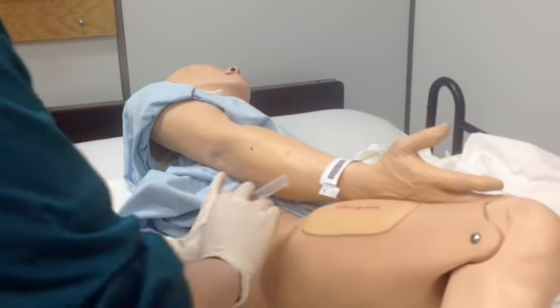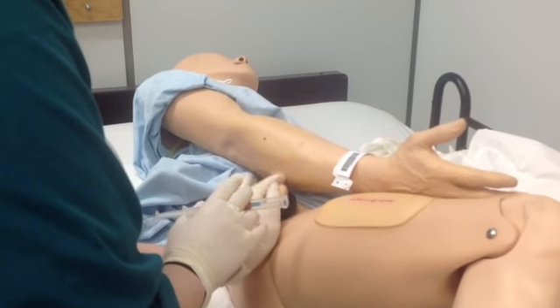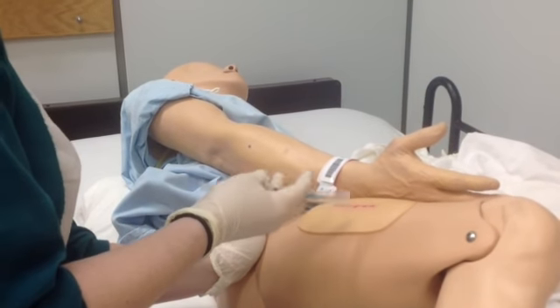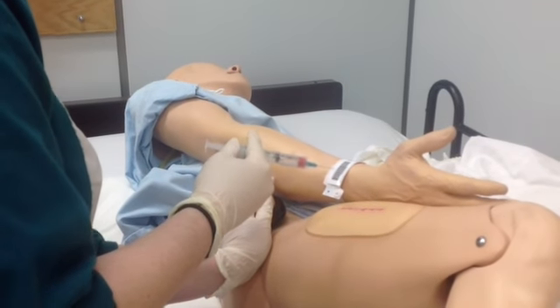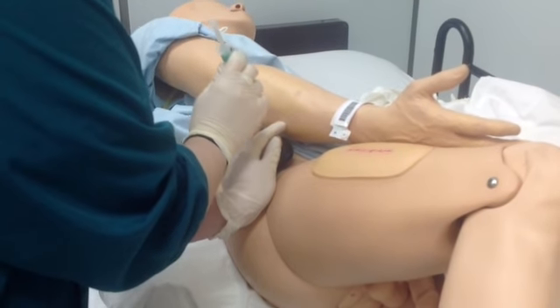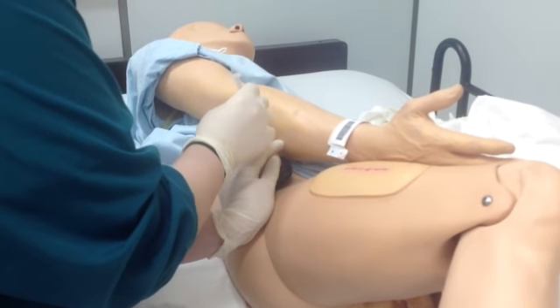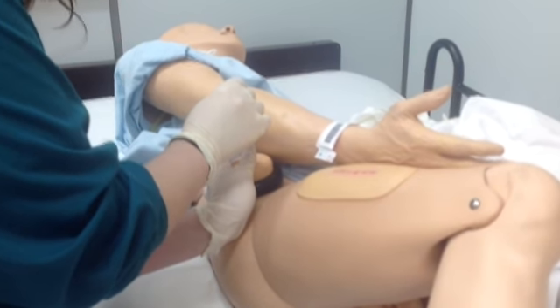So, it's sort of hard to hold this. I'm going to pretend I've got this spread out. I've already wiped it. My safety is on. Now, I'm going to pull the safety back. I'm going to hold it like a dart. I'm going to go in intently at a 90-degree angle. Now, I'm then going to switch my hands to hold it with my less dominant hand.